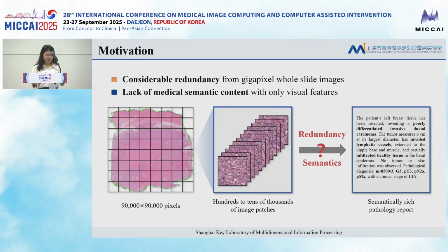First, whole slide images contain billions of pixels, including many regions irrelevant to diagnosis. Feeding all patch features into a self-attention-based encoder introduces excessive redundant information, making it difficult to identify relevant regions. Second, there is a large modality gap between pathology images and textual medical reports. Visual features lack semantic guidance, making it hard to generate reports rich in medical terminology.